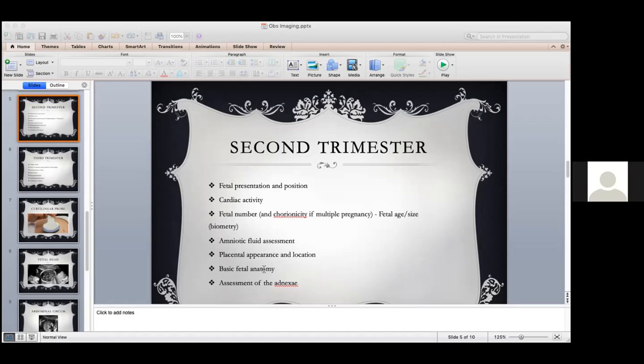Are there any brain anomalies, hydrocephalus, hydranencephaly? You want to assess the presence of all the intracranial structures that are accessible at that time. You want to look at the formation of the brain itself. Are there any anencephaly, all those anomalies that you can find in the brain.